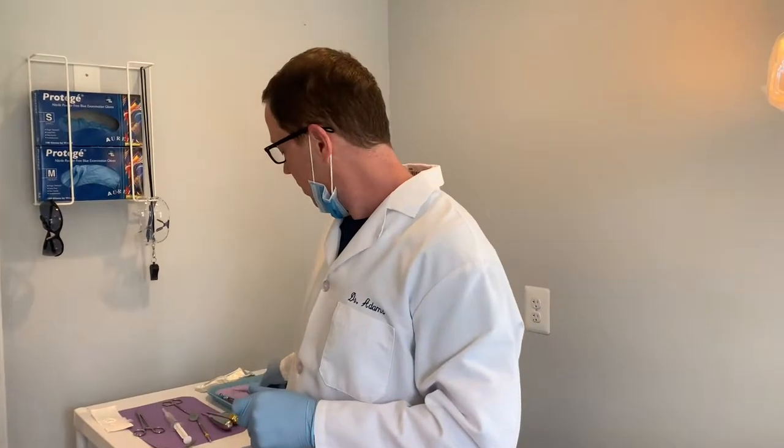And oftentimes with a dead tooth, there'll be some scar tissue. The body will grow a little cyst that'll wrap around the root of the tooth. And it's really important that you remove that tissue. That tissue actually grows around the root to prevent any bacteria or dead tissue from leaking into other parts of your body easily. So we want to get that out of the way, get the periodontal ligament out of the way. And once that's done, the bone cells can migrate into the area and grow new bone.